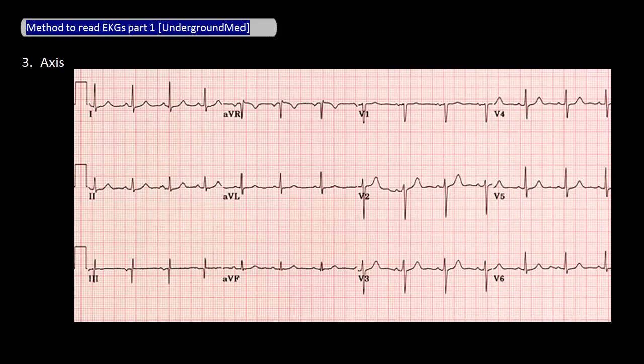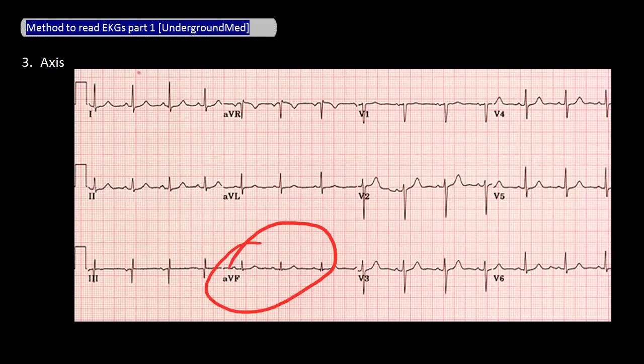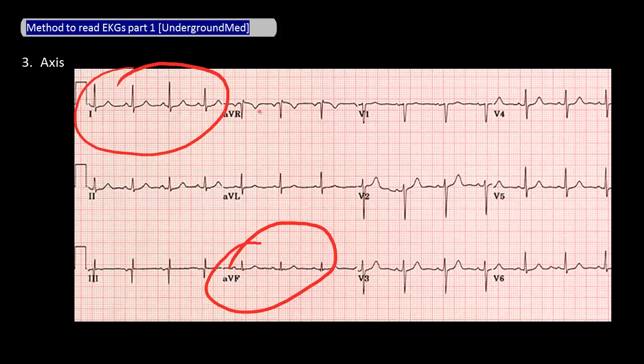After determining the rate and rhythm on an EKG, you want to determine the axis. In order to do this, you look at two leads: AVF and 1. When looking at these leads, ask yourself for each lead if the QRS complex is mainly positive or mainly negative — in other words, is the R wave more positive than the S wave is negative?